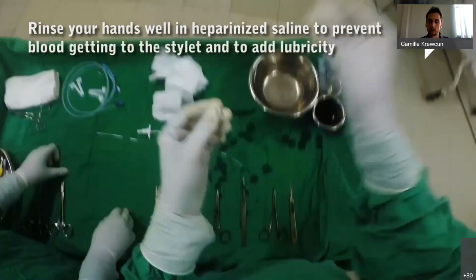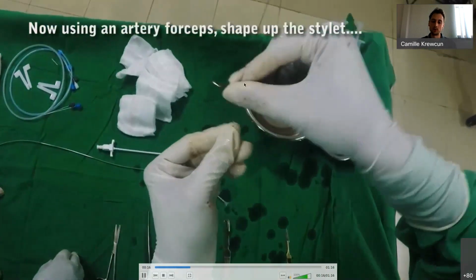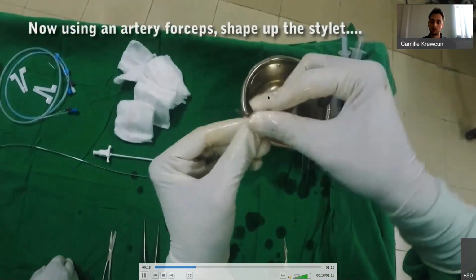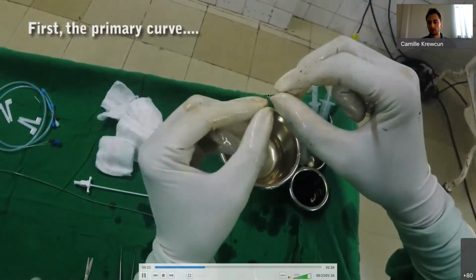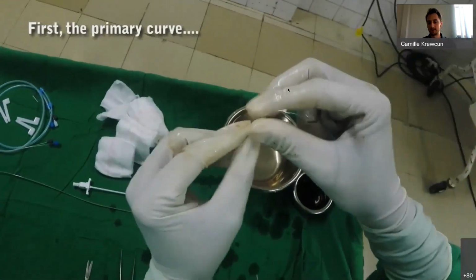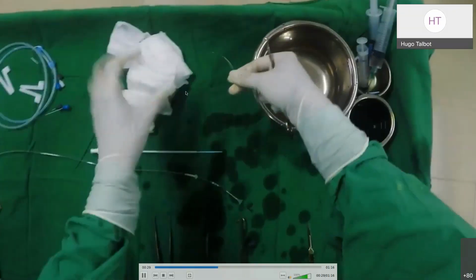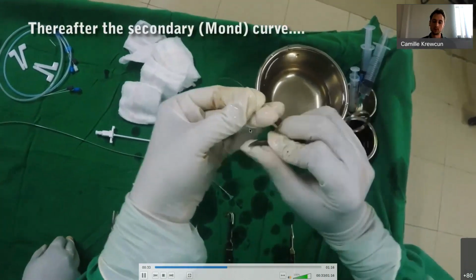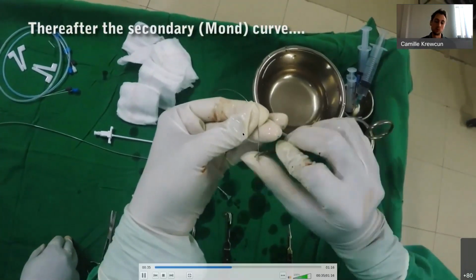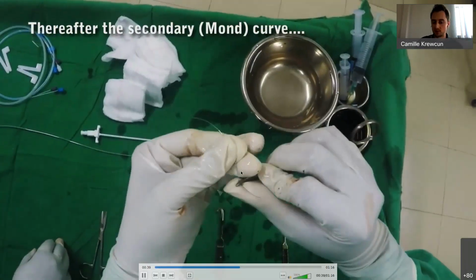which I hope we can see here on this video. It's the thin metallic wire that we can see here between the hand of the physician. Sorry, we do see the wire. Okay, cool. I do in the video. So you can see that this metallic wire, before inserting it in the lead to facilitate the navigation, is usually pre-bent by the physician in order to facilitate the placement inside the heart.